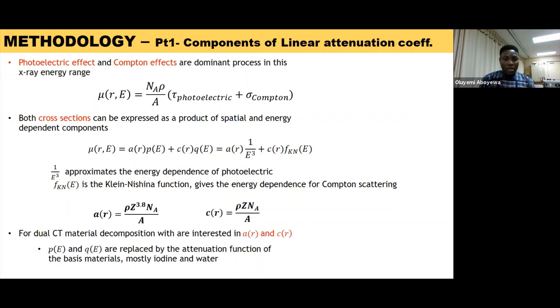And likewise, the Compton effect. We say the Compton effect is directly related to the electron density, and this expression here just gives you the electron density. The other aspect is the interaction cross-section, which is energy dependent. That was figured out with some weird mathematics by these two guys here, who worked on the Compton derivation to give us the scattering cross-section for the Compton effect.